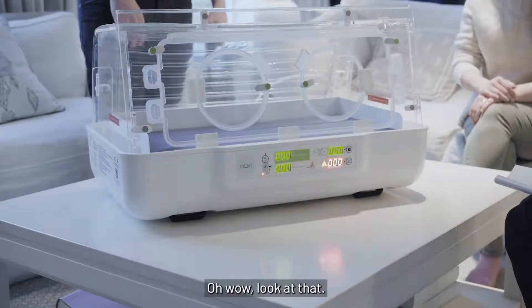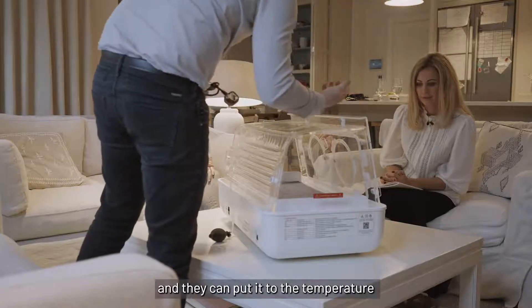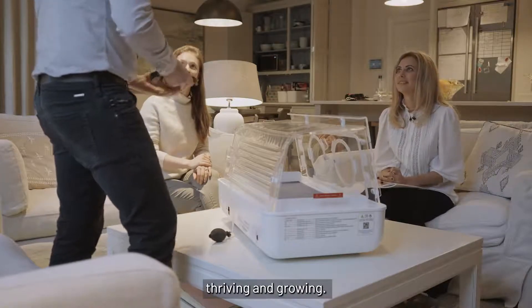Oh wow, look at that — just simple one-button operation, goes through all the tests. You've got very clear instructions for the user, and they can put it to the temperature the baby needs. It creates a really highly regulated thermal environment so they can spend their energy thriving and growing.